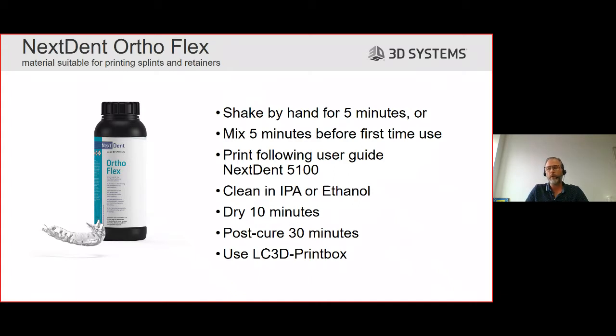Then you can continue with post curing. Post curing for this material is set for 30 minutes. The difference here is that we post cure with the supports in place. We make use of the LC3D print box.